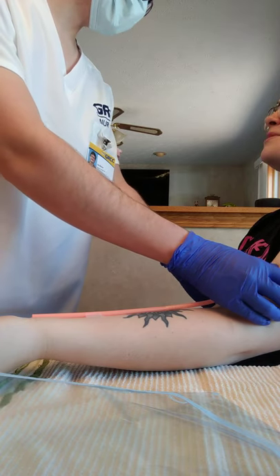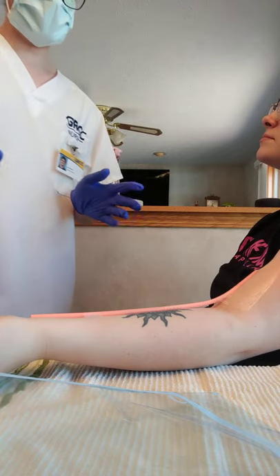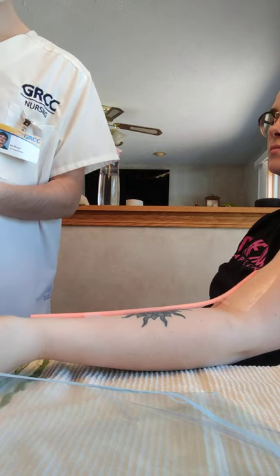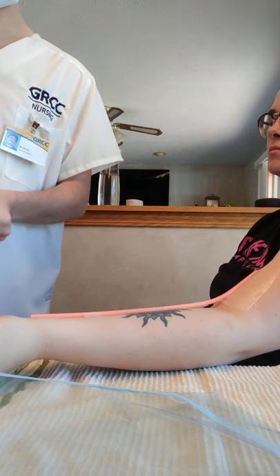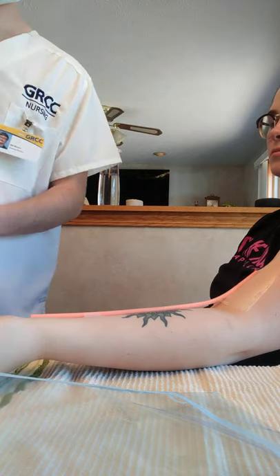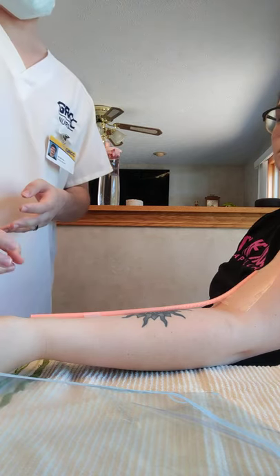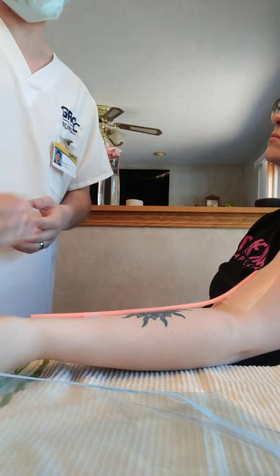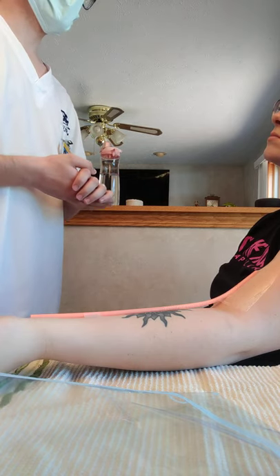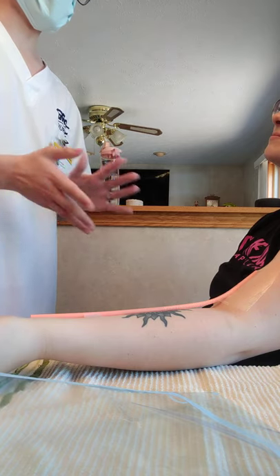Do you have any pain? No. Good. So I'm not noticing any signs of swelling or edema, which is great. So I'm going to remove my gloves. And then I'm going to wash my hands, and then if there was an end cap at the end of the port, I'll put on another pair of gloves and put on a new clean cap at the end of the catheter site. And this concludes my flushing and then locking in solution into your catheter.